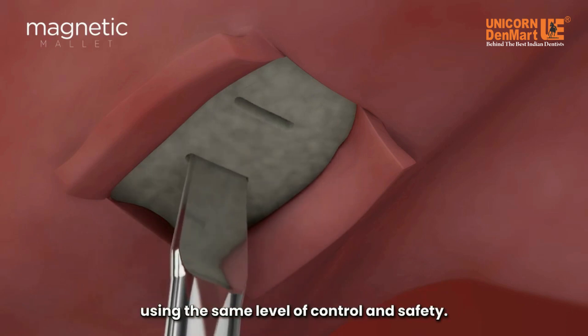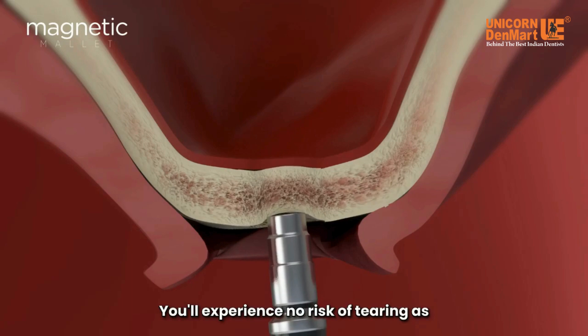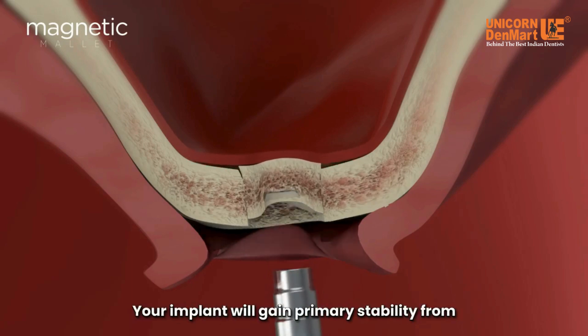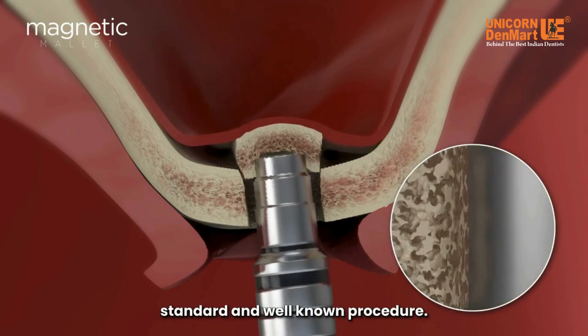You'll experience no risk of tearing, as you might with rotating or cutting instruments. Your implant will gain primary stability from the osseo-densificated native bone, thanks to a standard and well-known procedure.